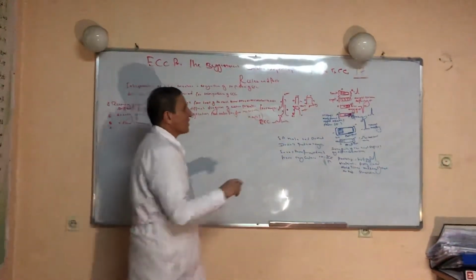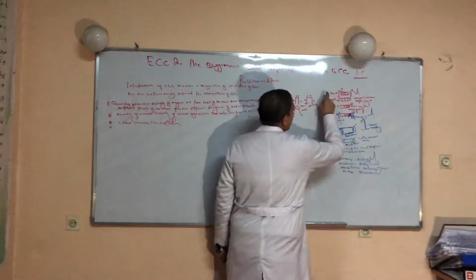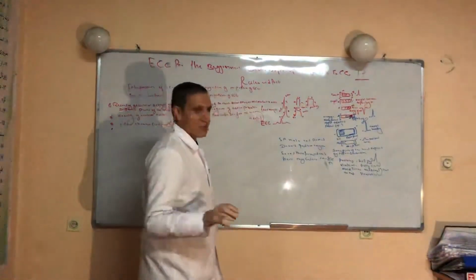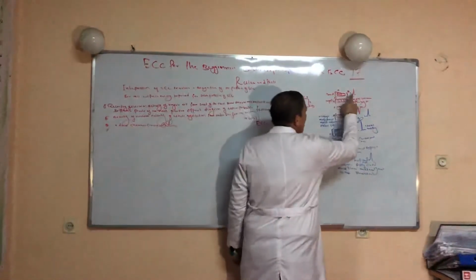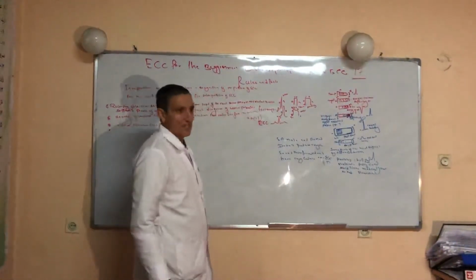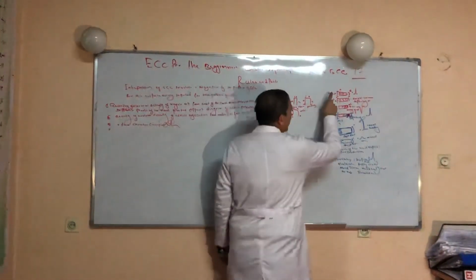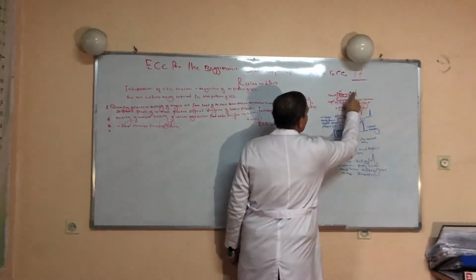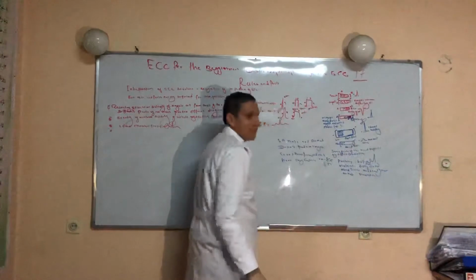After the dual chamber concept, we are coming to these illustrations. Remember, when a positive charge moves toward the positive electrode, it produces a positive deflection. It is very important: when a positive charge moves toward the positive electrode, the deflection in the needle would be positive. This is very important.